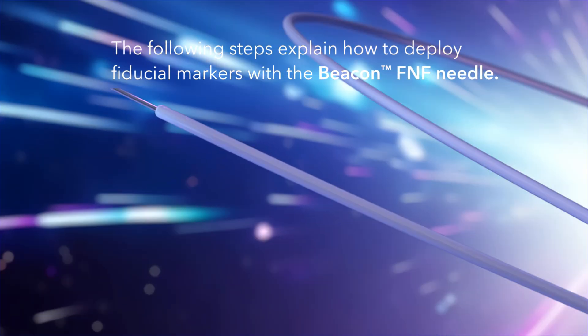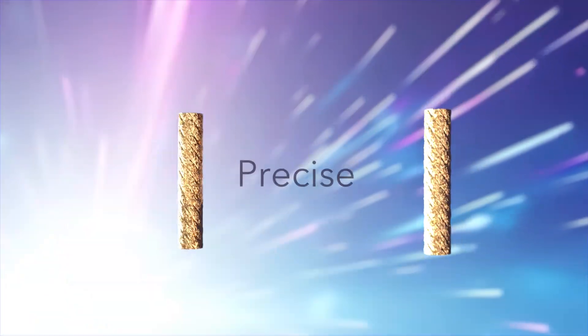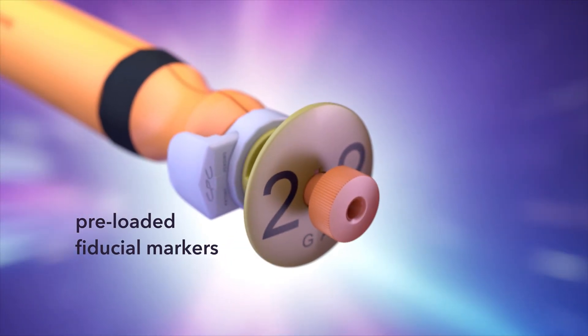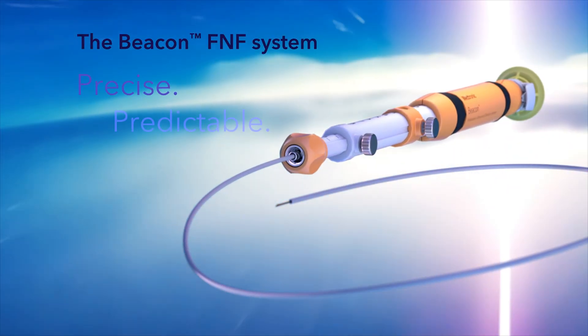Follow these steps when using the Beacon FNF Needle, which comes preloaded with two solid gold fiducial markers so placement is quick, precise, and efficient. Say goodbye to unnecessary steps and wasted time, and bring a new level of efficiency to your practice. The Beacon FNF system: Precise. Predictable. Preloaded.